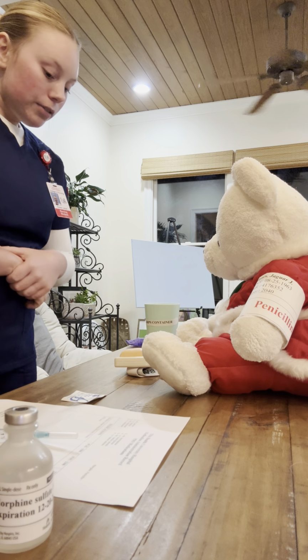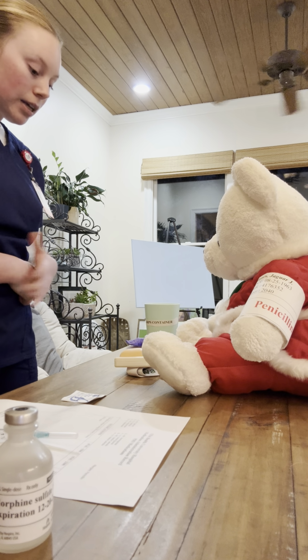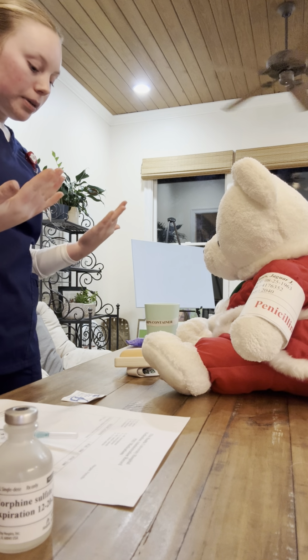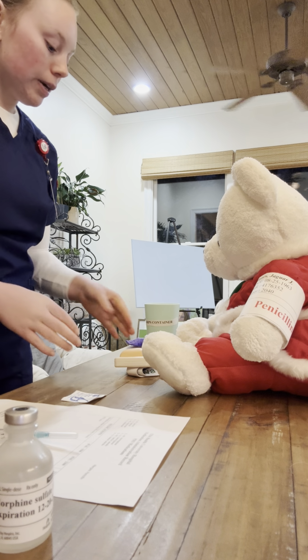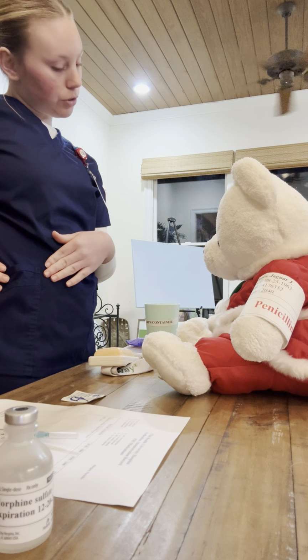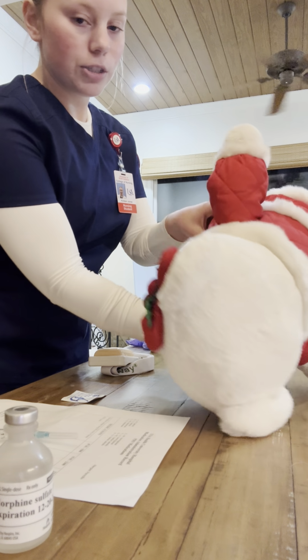All right, Mr. Jones, I'm going to be giving you your morphine injection today to relieve your pain. I'm going to perform hand hygiene one more time. I'm going to raise your bed up, lower your side rail, and then position you comfortably, all right? I'm going to position you on your side because I'm going to give you your injection right here in your hip on your ventrogluteal site. So I'm going to have you just lay on your side like that.